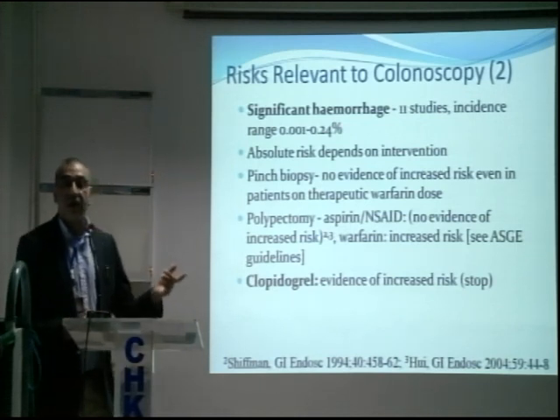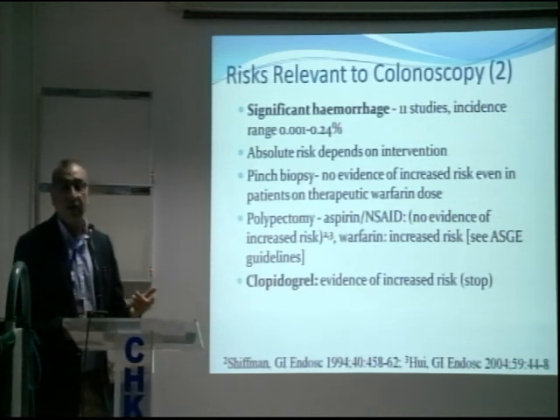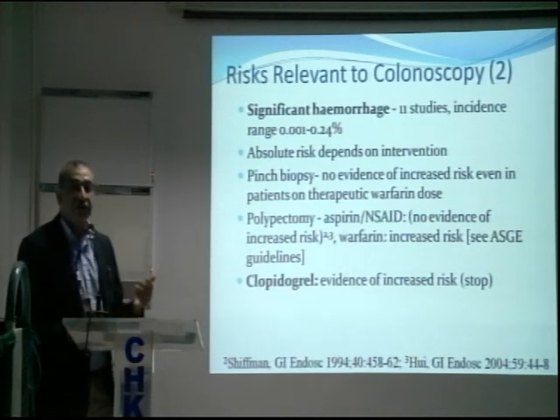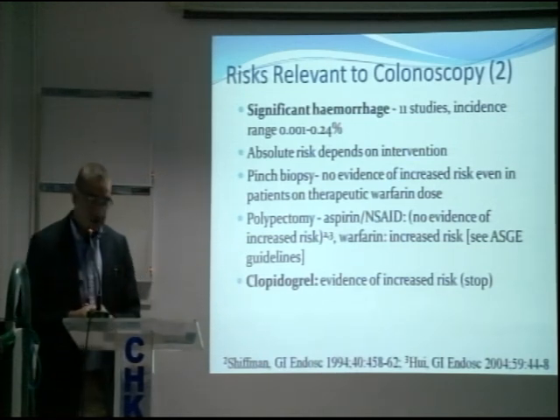Hemorrhage only occurs if you carry out a therapeutic procedure, like polypectomies, EMR, which again is a form of polypectomy, or dilatation of the colon for any reason, or stent insertion. So those are possible risks associated with it. The risk increases if the patients are on anticoagulants. And there's a protocol for the use of anticoagulants during the procedure. So if you are contemplating a therapeutic procedure, then your patients must stop their anticoagulants according to the recommendations.